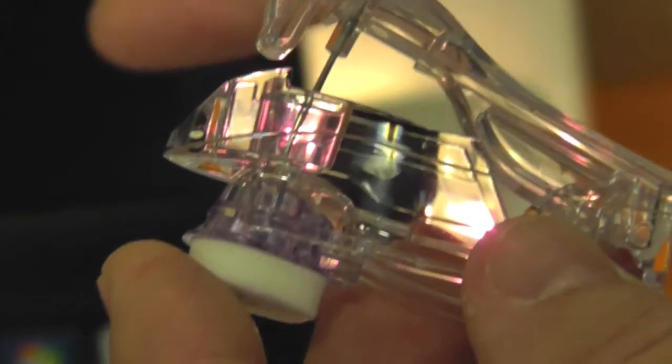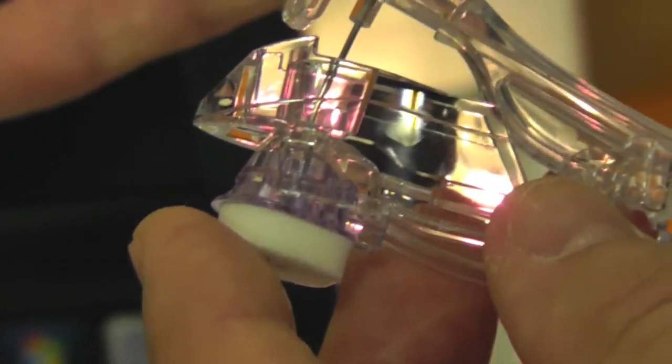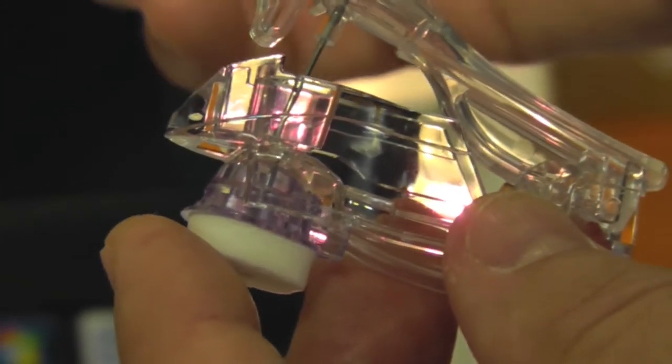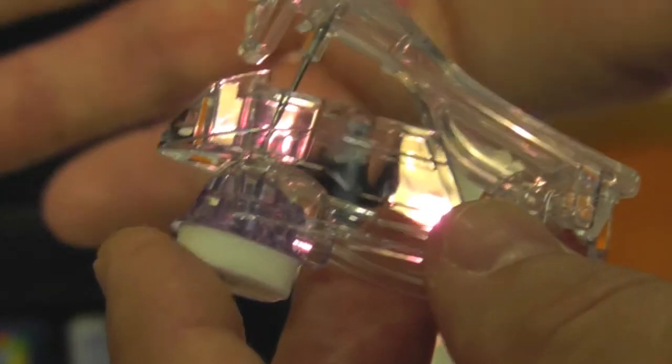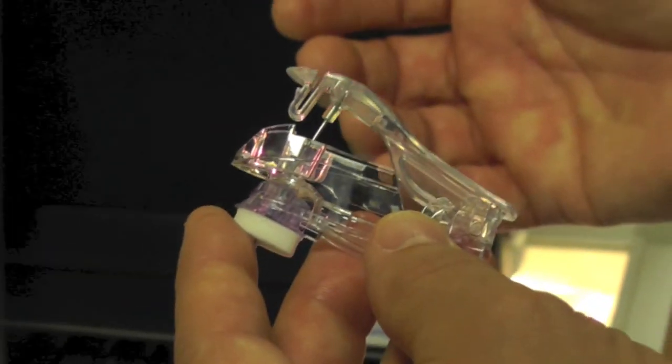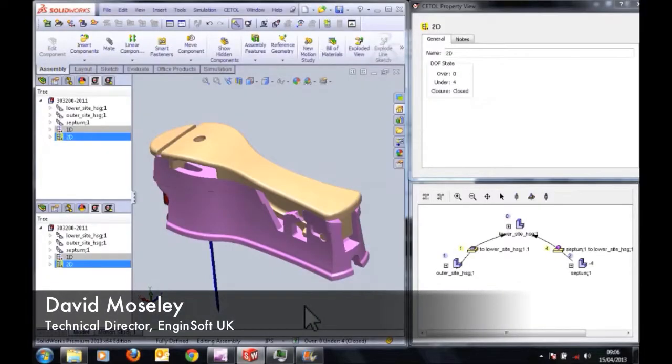So let us show you the actual software and show you how we would measure and then identify the play, if you will, on that seal, and show you how the software can be used to get better information to make better design decisions. Okay, I want to show you how easy it is to use CETOL to analyse the seal condition that Tim just referred to. So here's our infusion port device. It's modelled in Solidworks. I could equally well be using Creo or CATIA.